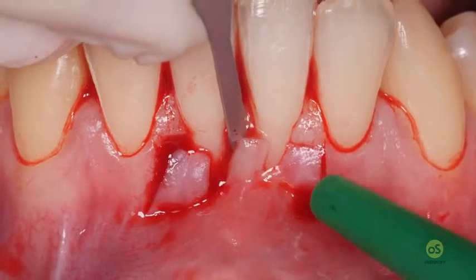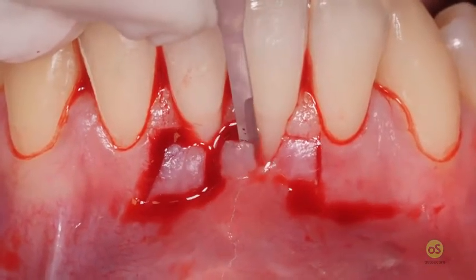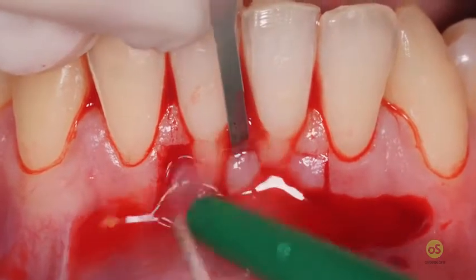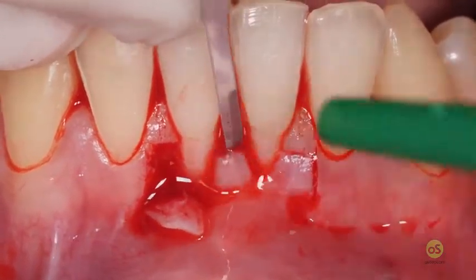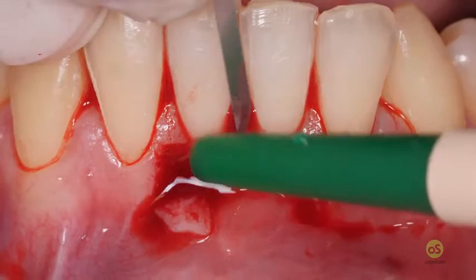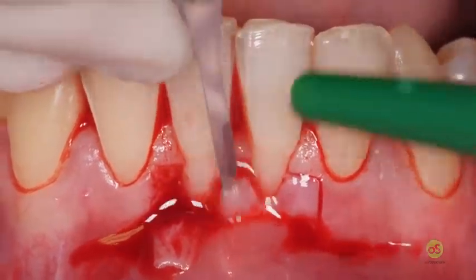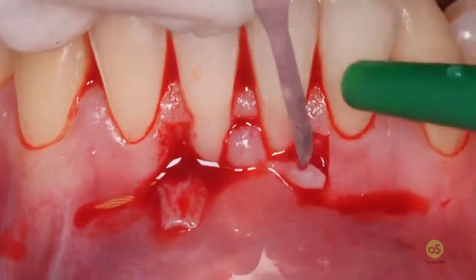Now the whole papilla from one to the second recession is elevated. Quick. Now we have 1, 2 and 3.